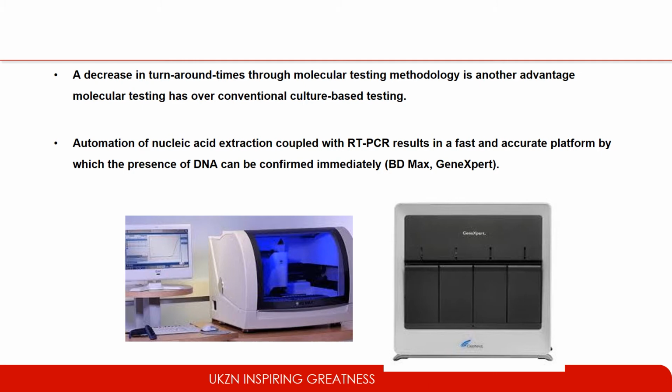The sputum sample is simply loaded into the machine, DNA is extracted, and amplification takes place thereafter on the extracted DNA. So this type of system has even increased the efficiency of the conventional traditional real-time PCR, and it is a platform that is most commonly used now in diagnostic laboratories because these instruments are approved for diagnostics.